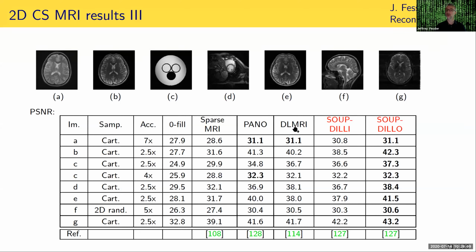Dictionary learning MRI, that was Saiprasad Ravishankar's own work that he did in his doctoral research before he joined me as a postdoc. So that was his own worst competition in a sense. That method used KSVD to model the patches instead of this aggregate sparsity model that I've been advocating for here. And you can see that using the zero norm with this adaptive dictionary, where you're learning the dictionary from this patient's own k-space data, consistently led to the highest PSNR across all of these different examples with different levels of undersampling and different kinds of anatomy.